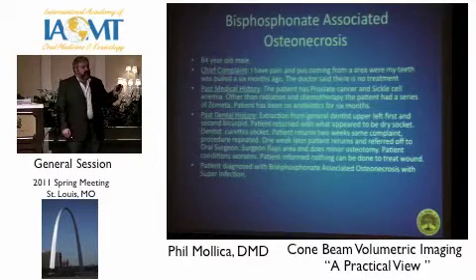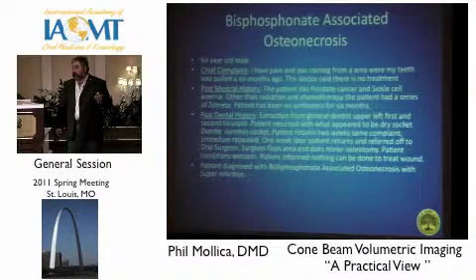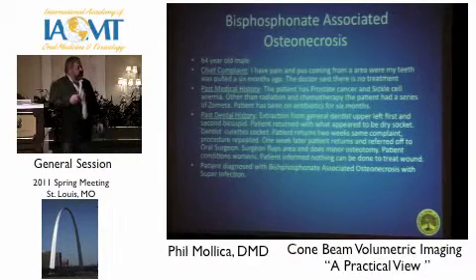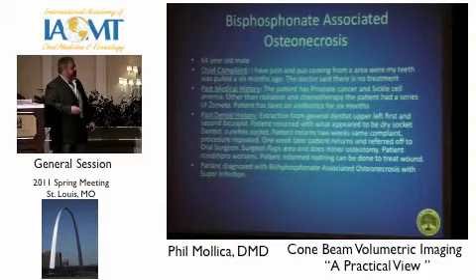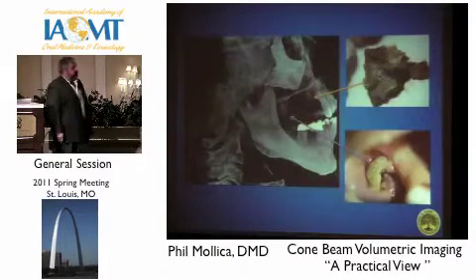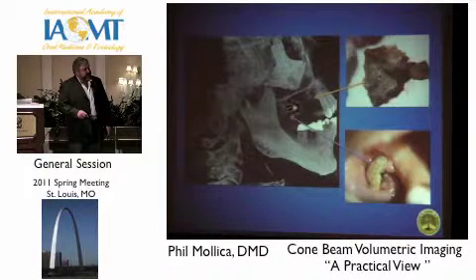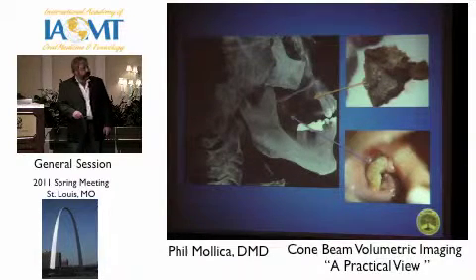You remember, when you're talking about ischemic issues where there's no blood flow, how do you get these antibiotics into the area? You can't. So this is where you do localized therapies. You integrate a bunch of little different biological things, oxygen ozone, maybe hyperbarics, vitamin C, all kinds of little tricks, which we don't have time to really get into. So when we look at a case like this, we take the little ceph, and in this particular case, you see the distal aspect of the maxilla at that particular time was perforating through the tissue itself.